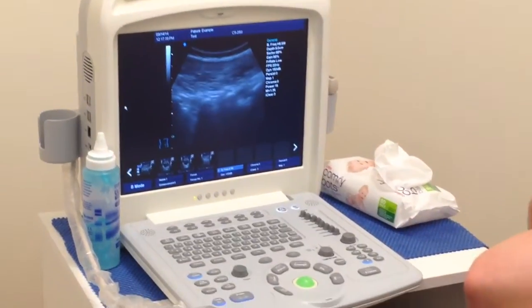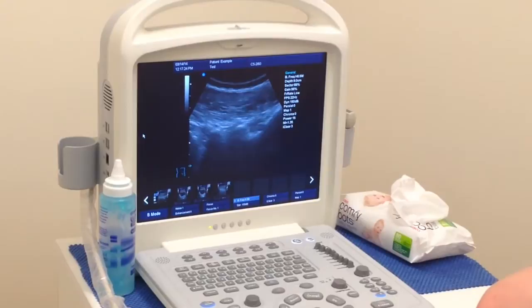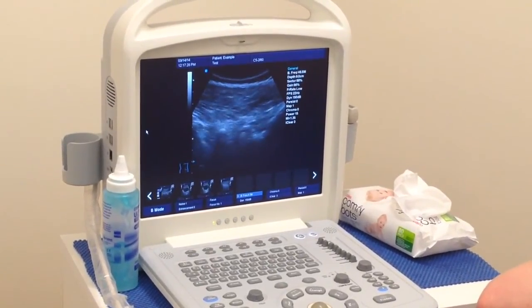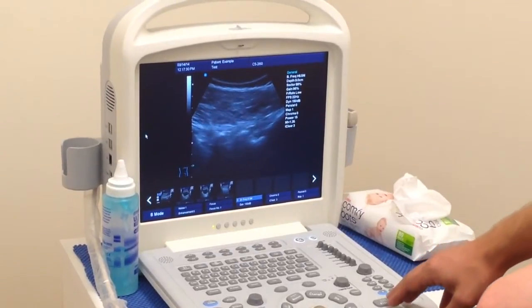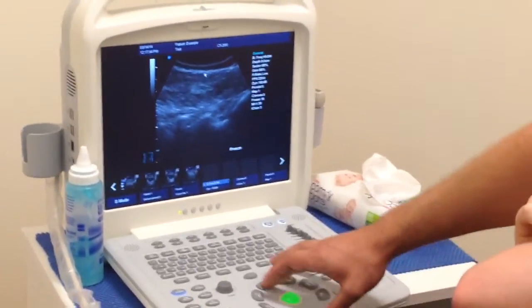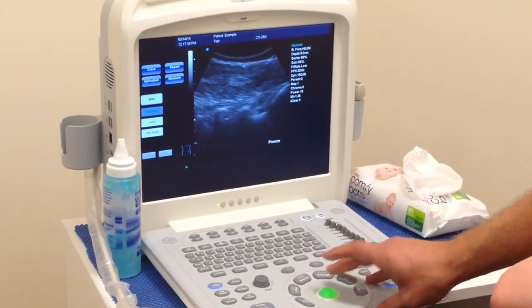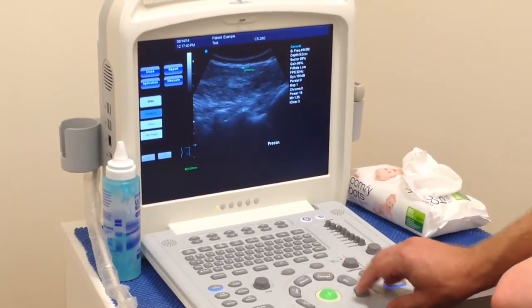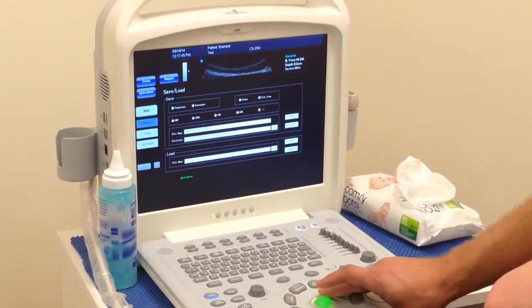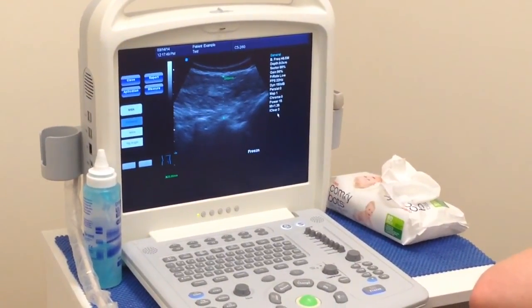I'm going to hit the freeze button, we're in the same position still. I'm going to get you to switch on that muscle for us. So turning on, push, push, push. Okay, we're going to measure that again. Save that, so we've got that for our records, because as we do some training, we're going to hopefully improve that over time.